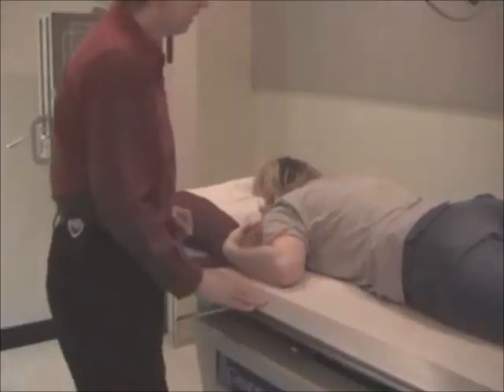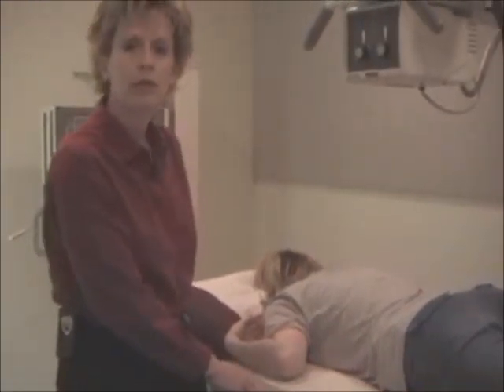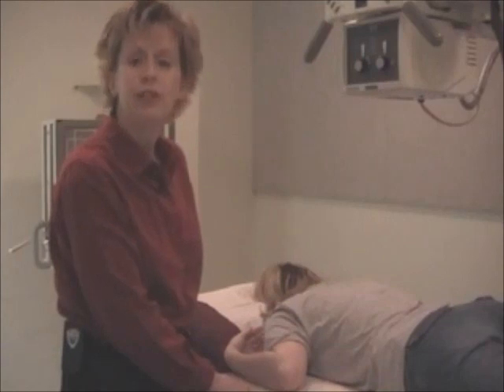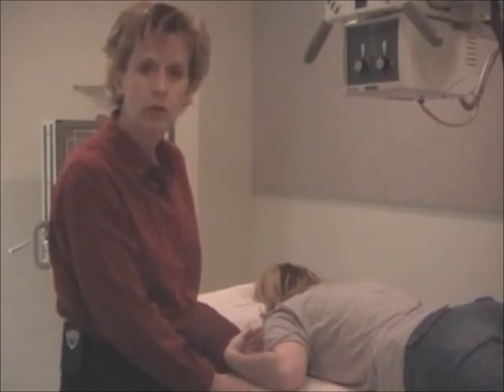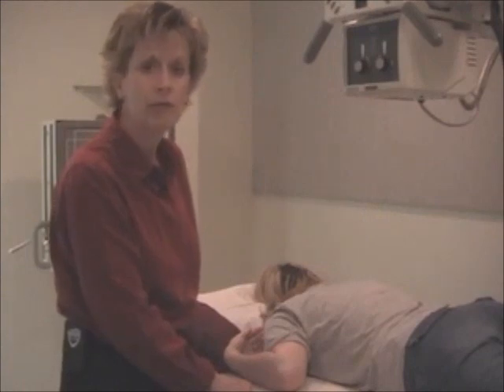Now, during a small bowel follow-through, maybe an hour and a half into the procedure, the doctor sees something on your overhead films and they may say, let's go do fluoro. You need to be ready for that. They may want to do an overhead spot in that case. And then you'd come back to taking your overhead film. So be ready for anything with the small bowel.